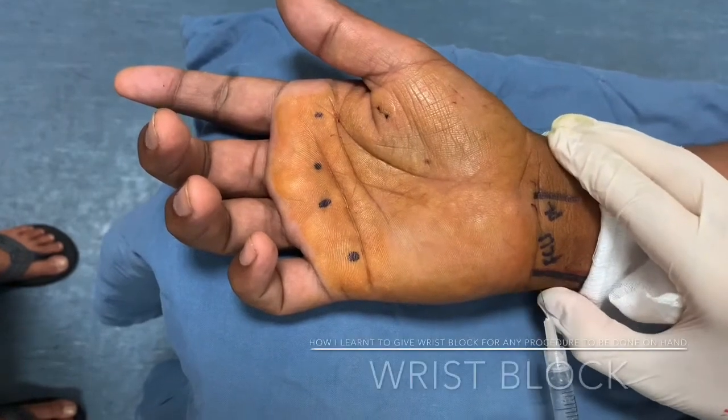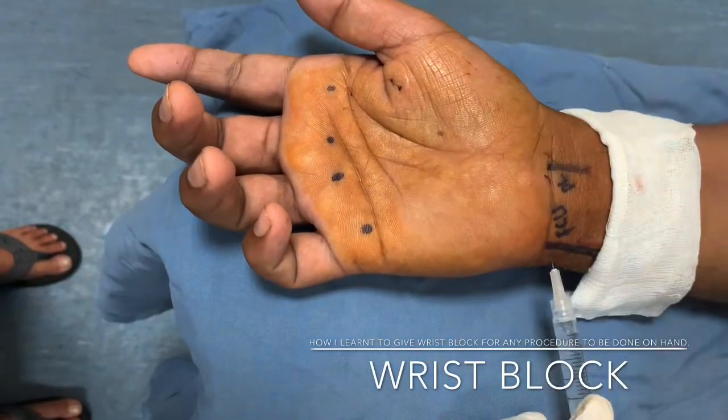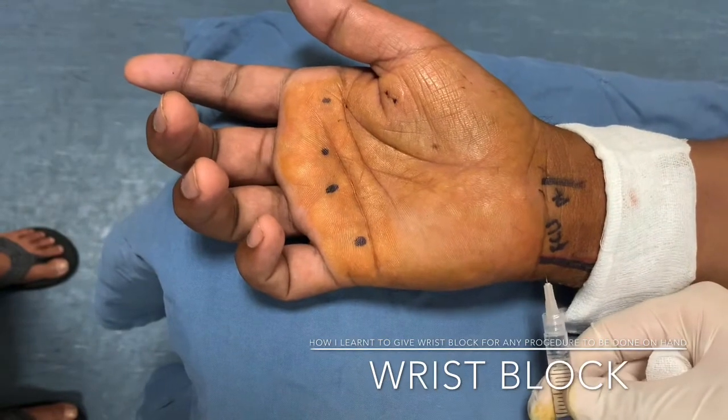Hello everyone, this is Dr. Regidor. Today I will show you how to give a wrist block while planning any procedure to be done on the hand.